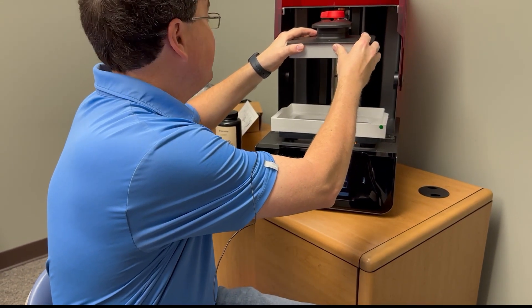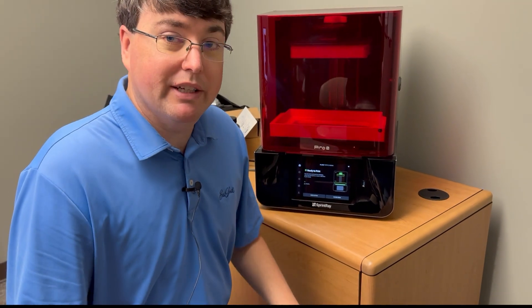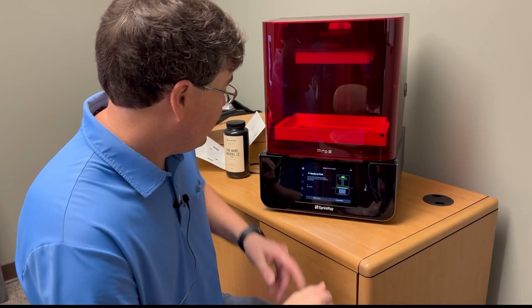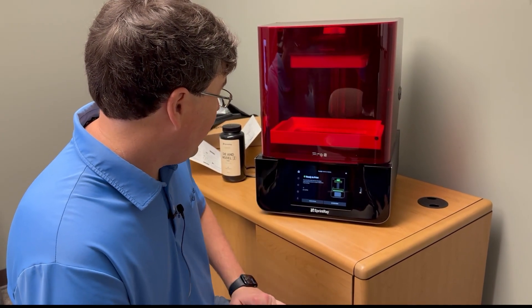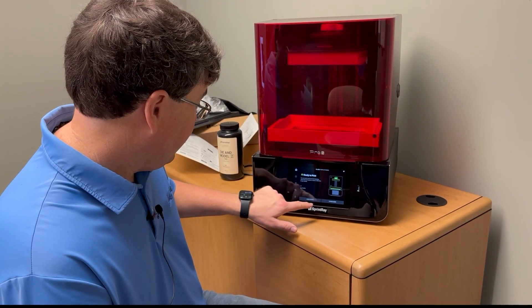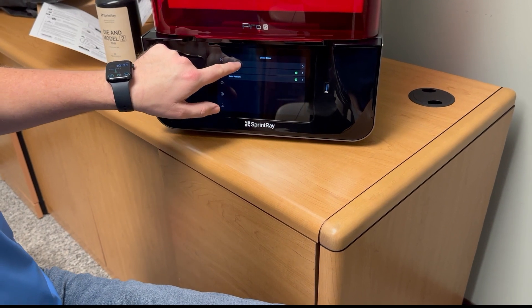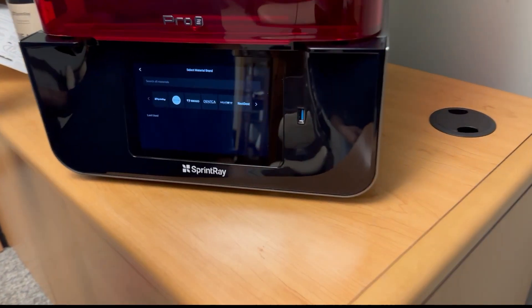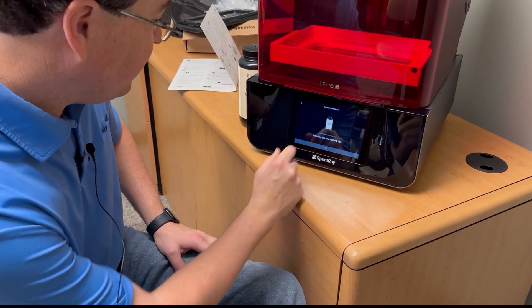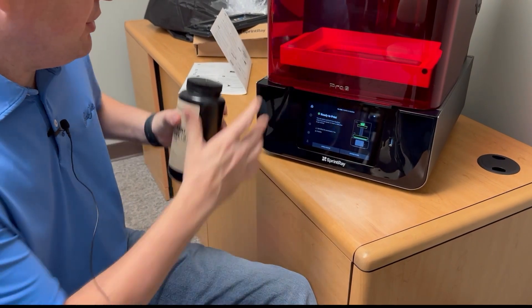Sometimes you get an error that says it has no build plate even when the build plate is on there. Simply undo the build plate, snap it back in, redo it, and it resolves the issue. So you can send a print job from Rayware, from the queue, or insert a USB drive to get started. Everything looks healthy. Let's look at the two buttons here: 'Change Resin' and 'Check Status.' Check status — resin tank: green check mark. Build platform: green check mark.